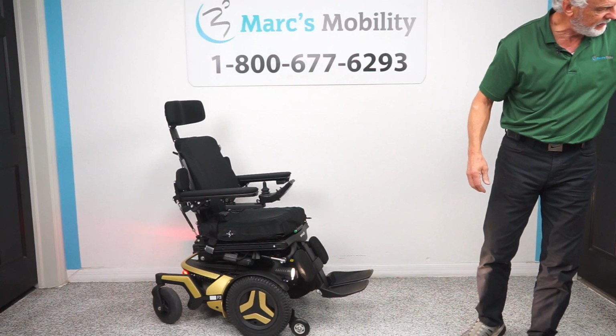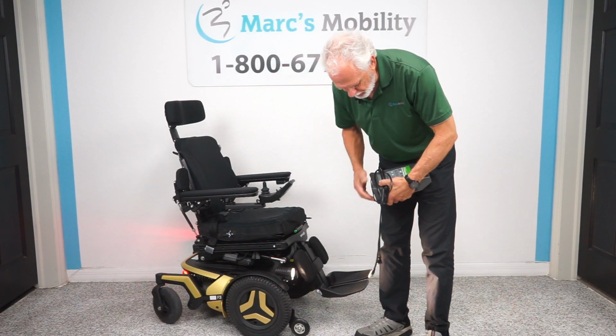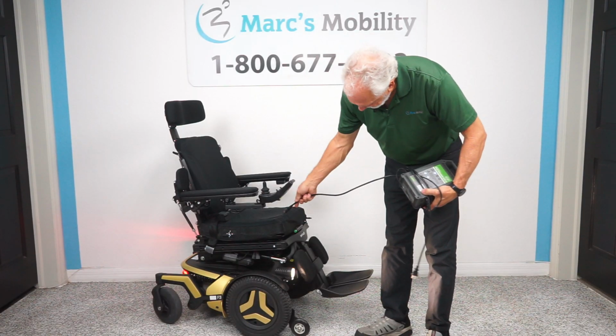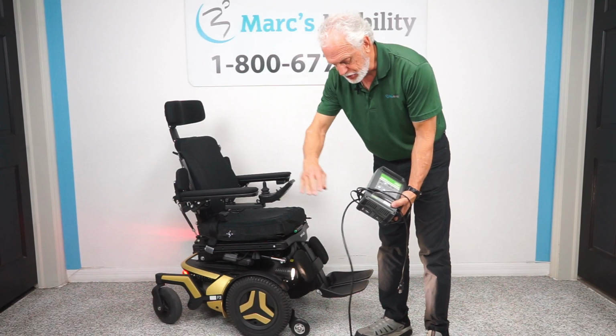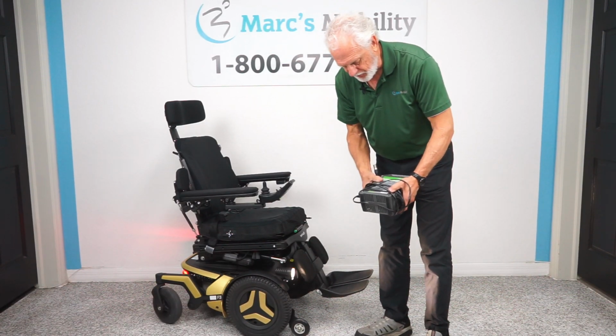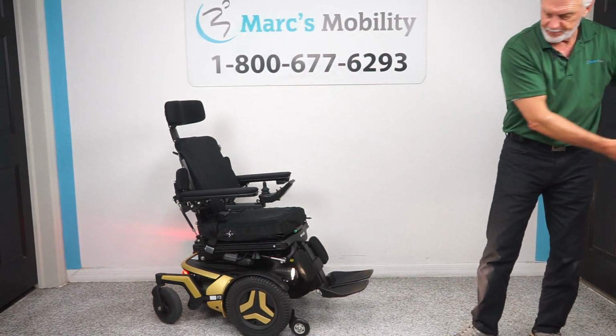Sorry about that, folks. This is a Permobil charger, but they all work the same way. Different shape. This one plugs here also, and as soon as the light goes to full, the battery charger will stop charging when the batteries are full. These are smart chargers. They know when to stop when the batteries are full.